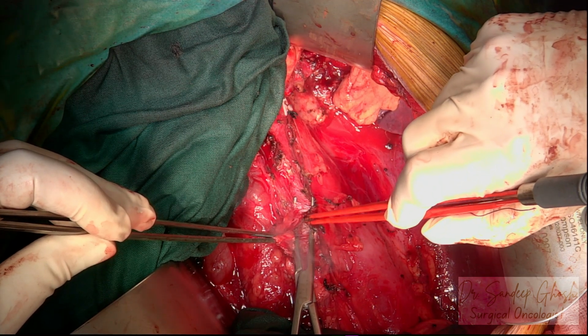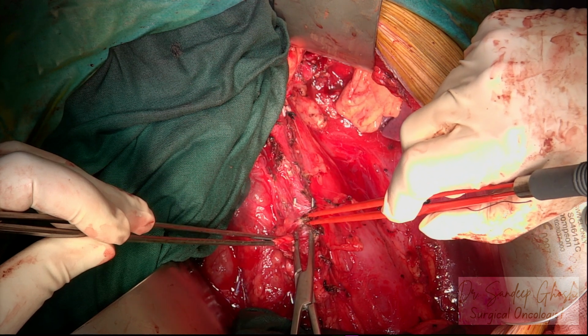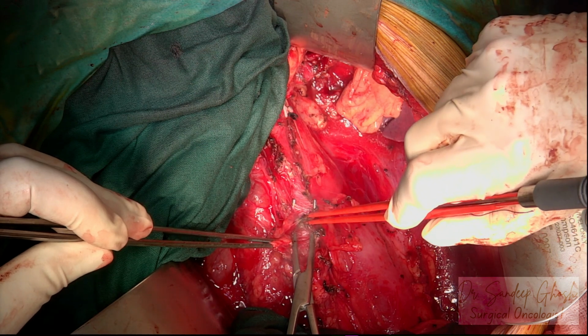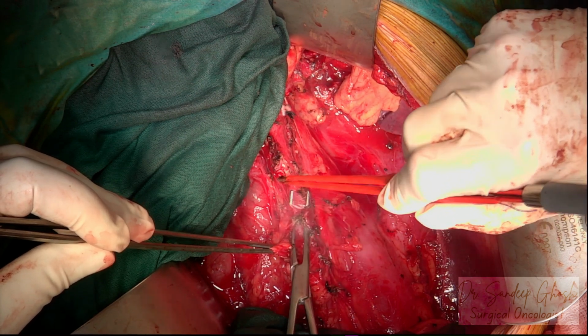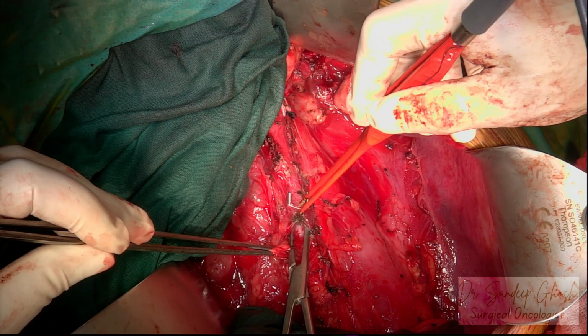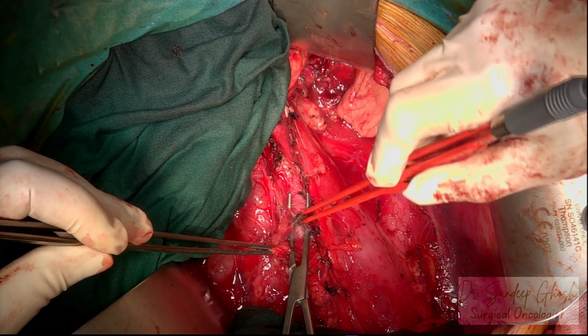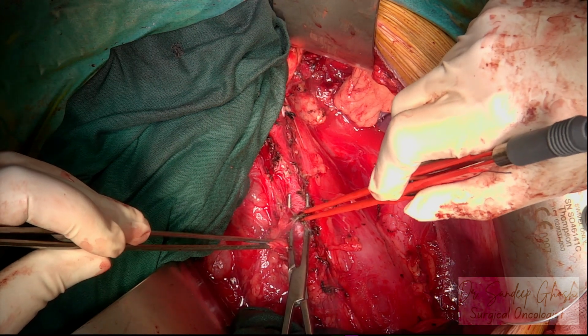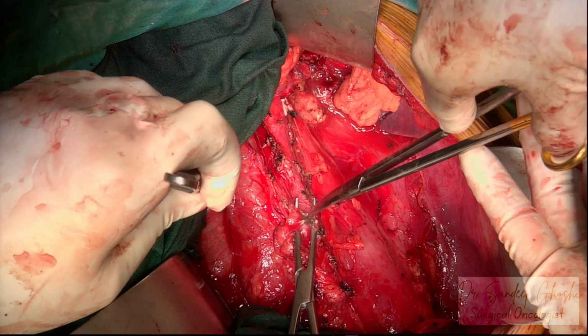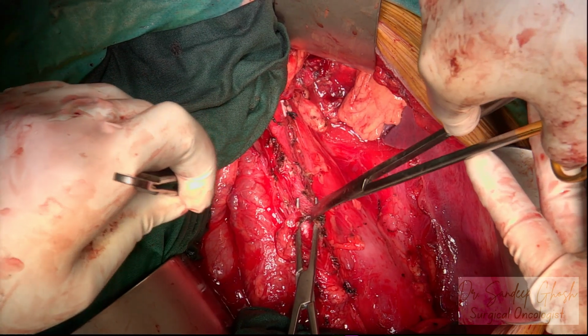Now we are working on top of the aorta. We are basically doing a split and roll technique. Firstly, we are splitting the lymph nodes in the center of the aorta here, coagulating with the bipolar, and we will be cutting here with the scissor.